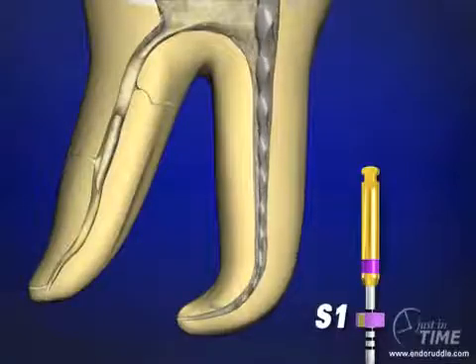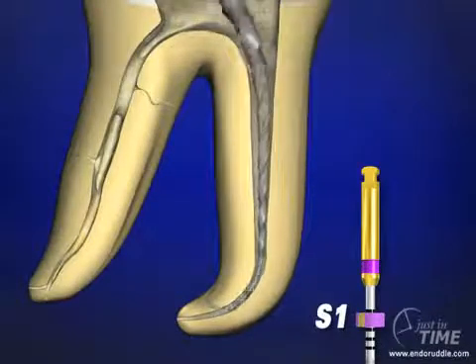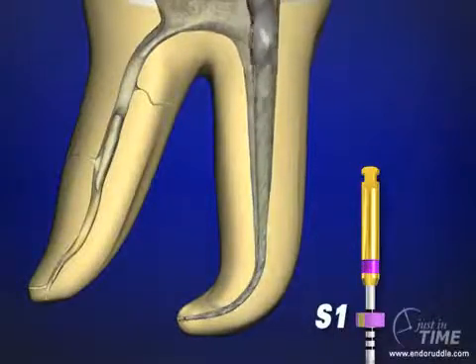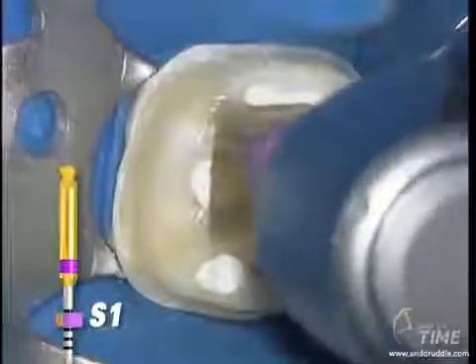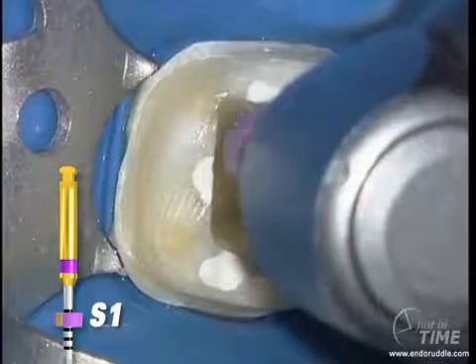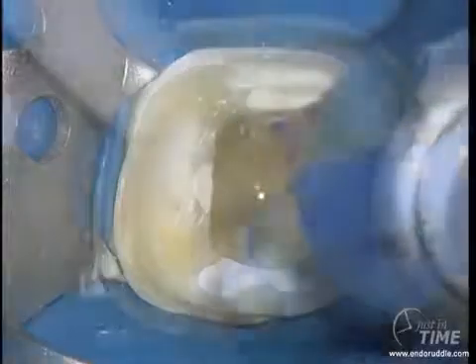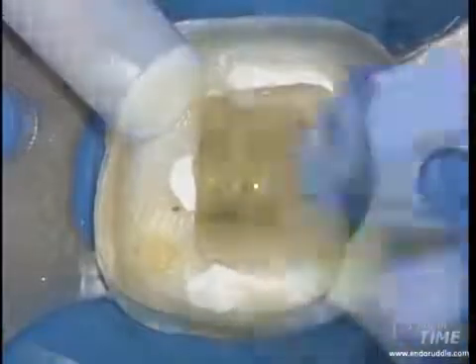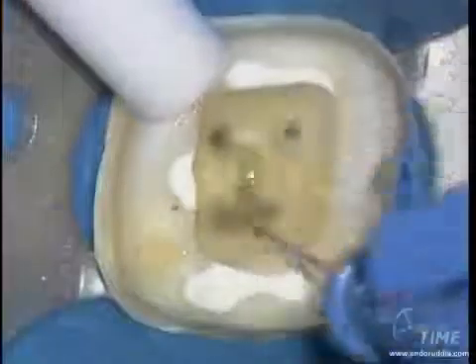In one or more passes, we can carry the first shaper file to length, again using a brushing motion. We'll carry a deeper wave of shaping into the deeper portions of the preparation. By brushing and creating lateral space, it allows the instrument to easily float to the desired length. When the desired length has been achieved, remove the instrument, irrigate, recapitulate with the 10 file, check patency deliberately and frequently, and then re-irrigate.